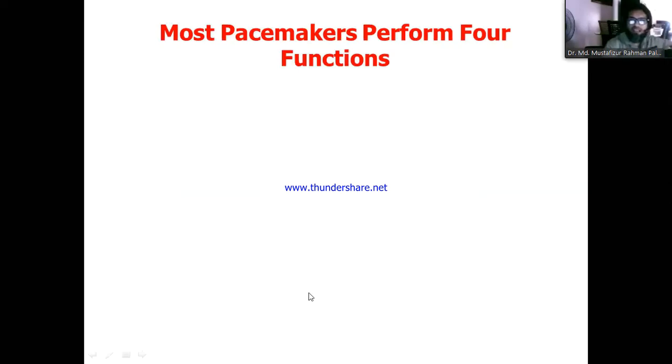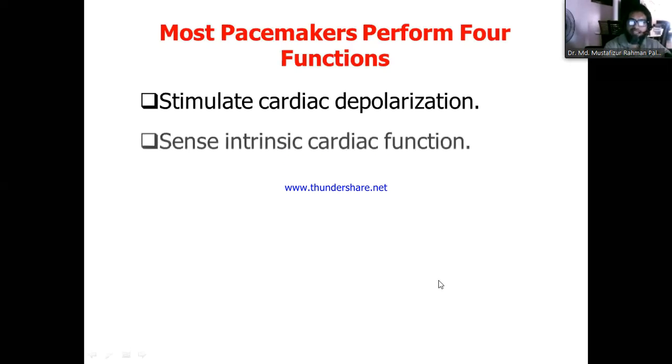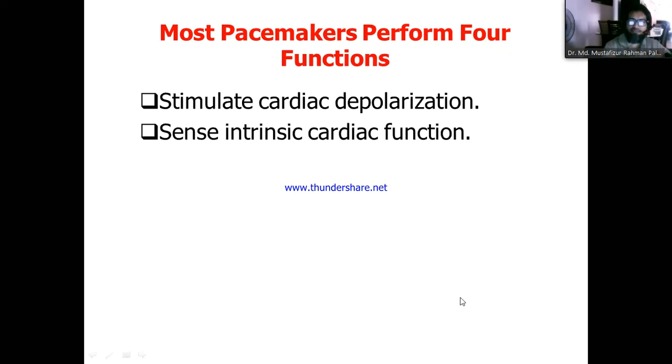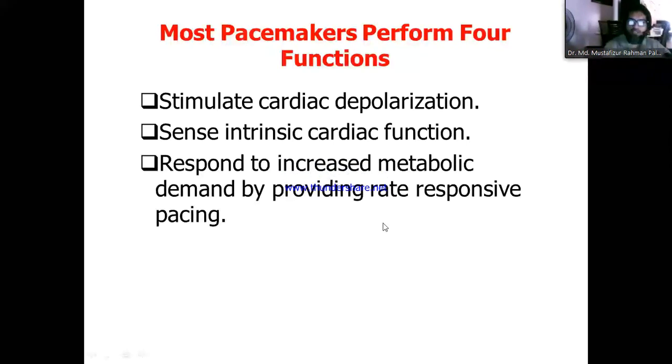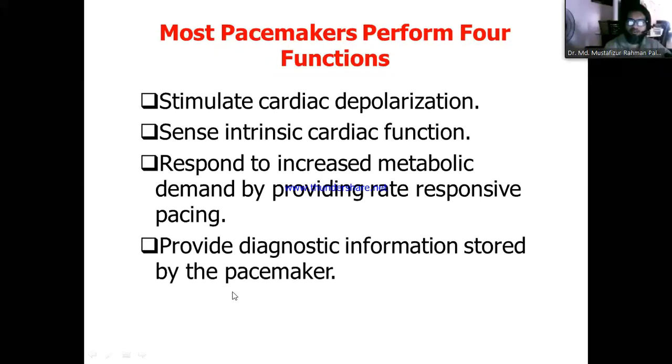So the basic functions are three, and other than these, most pacemakers perform four functions. That is, stimulate cardiac depolarization, sense the intrinsic cardiac function, and also respond to the increased metabolic demand by providing rate responsive pacing. And another important function is the diagnostic information stored by the pacemaker. The pacemaker can store the information, and you can later print it and diagnose it.